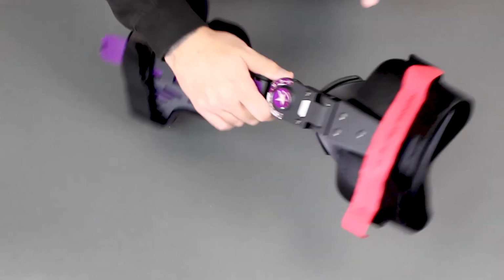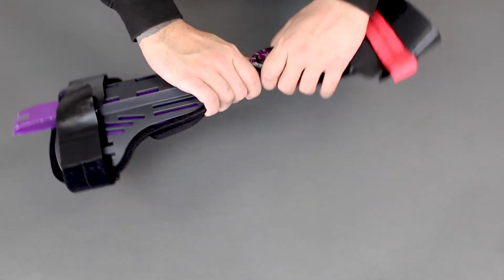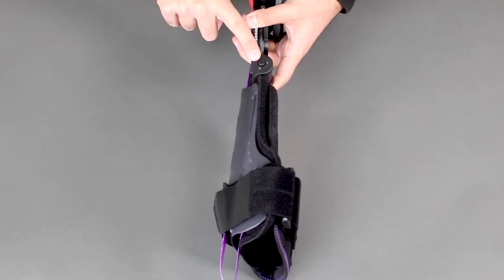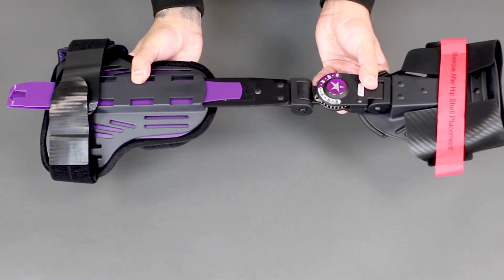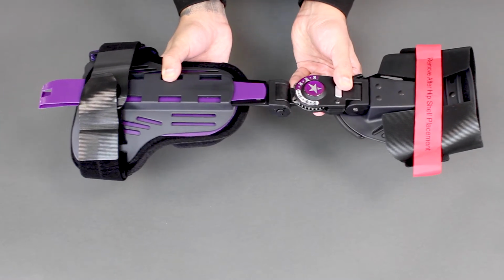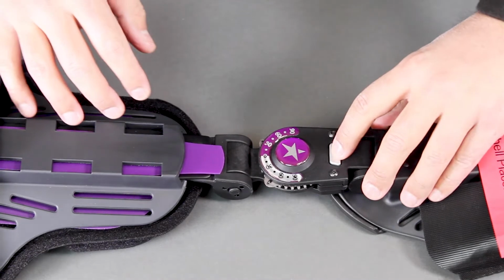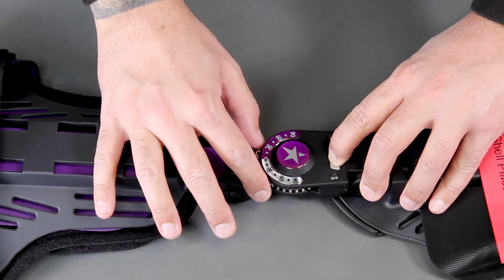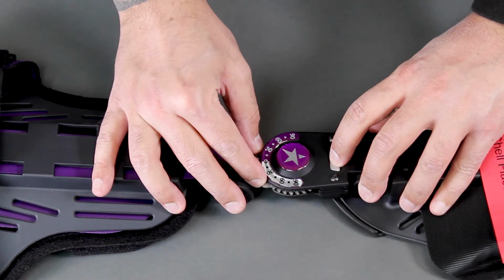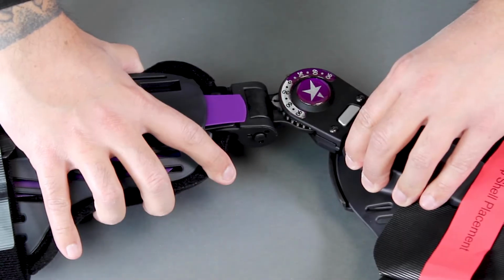There are 4 adjustable components on the strut: pelvic shell hinge, range of motion hinge, abduction hinge, and the telescopic thigh section. Below the pelvic shell you will find the proven Orthomerica hinge. The maximum range of motion is 120 degrees combined. The flexion and extension can easily be adjusted by pressing the centre button to set the desired flexion and extension.